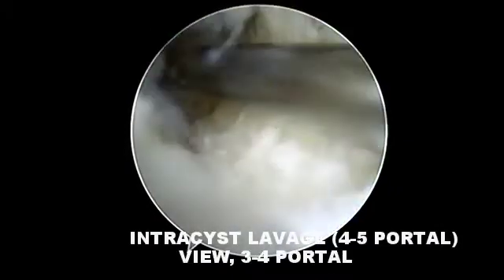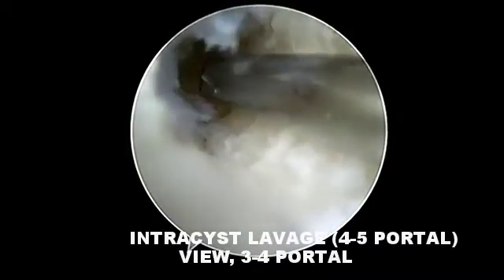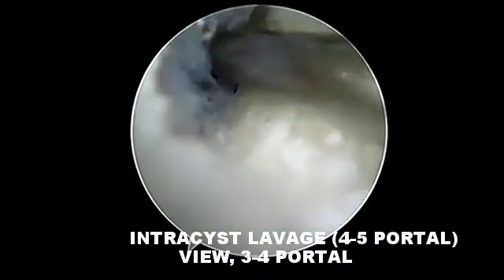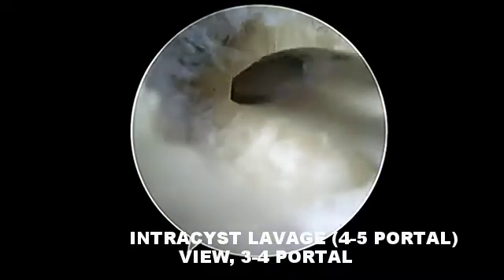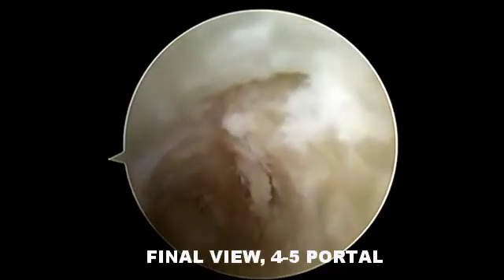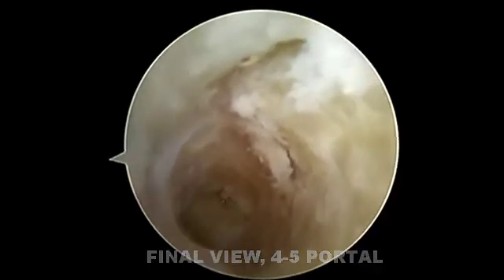After completion of the curettage, a large bone needle is used to wash out the debris from the cyst cavity. A bone grafting procedure may be performed at this stage if necessary. The final cystoscopic view shows complete decompression of the intraosseous ganglion.